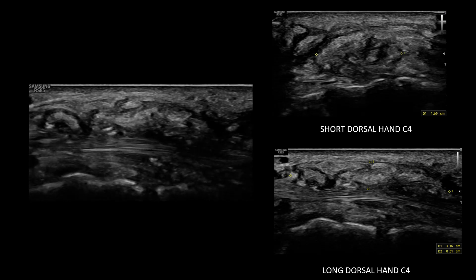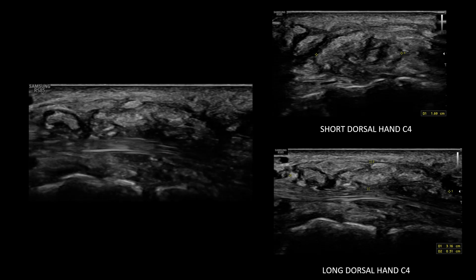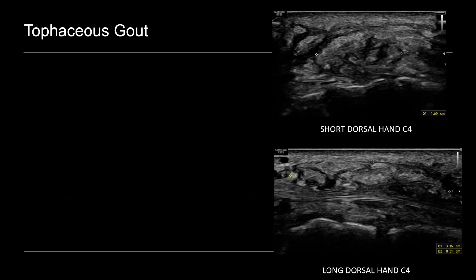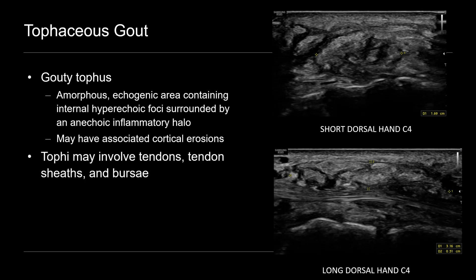This is another male patient in his 50s with a history of gout presenting with a right hand mass. In the area of the fourth extensor compartment, there's an amorphous echogenic mass-like structure. In long axis, it's directly overlying the extensor digitorum tendons of that fourth extensor compartment. With dynamic imaging — having the patient flex and extend the wrist — these amorphous echogenic structures partially surround the tendon and impinge upon it, but are separate from it. This is an example of tophaceous gout within the tendon sheath. A gouty tophus on ultrasound usually appears as an amorphous echogenic area containing punctate echogenic crystals surrounded by a thin anechoic inflammatory halo, and may have associated cortical erosions if they abut the bone.